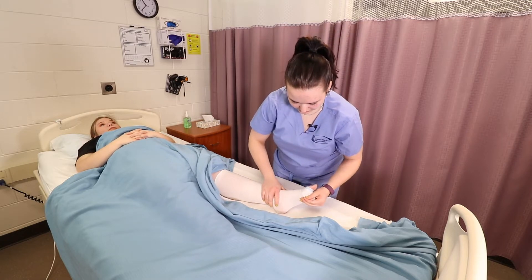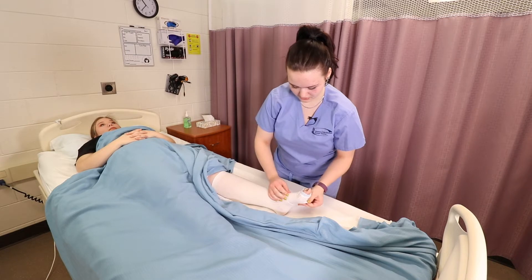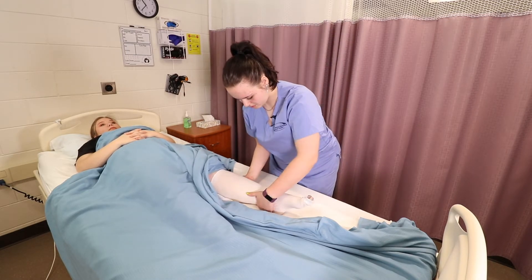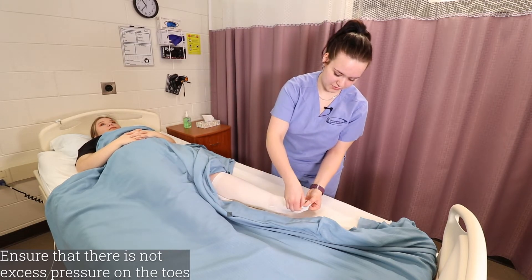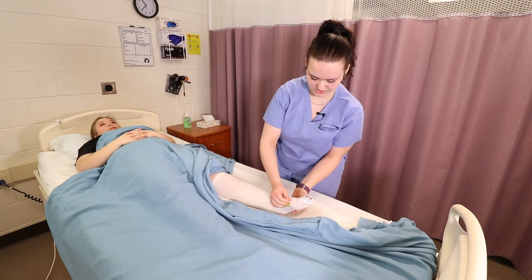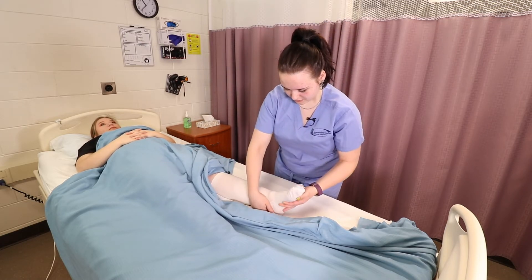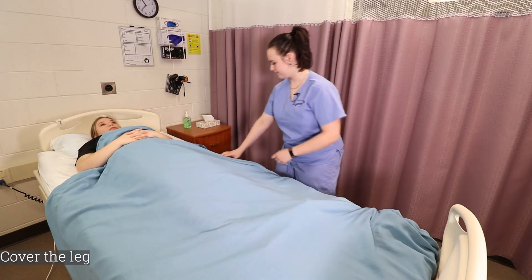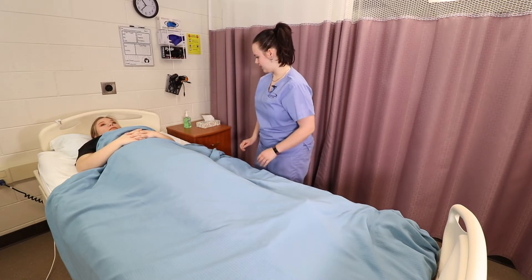I'm now going to check for wrinkles and make sure that the stocking is smooth. I'm now going to check for pressure on her toes to make sure that there's not too much pressure cutting off circulation. I'm now going to pull the blanket back over and lower the bed.